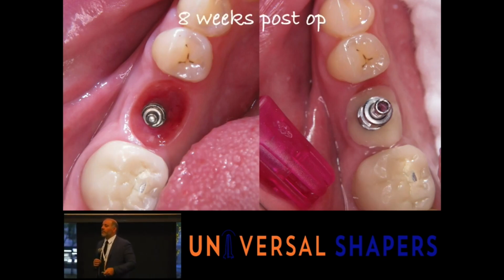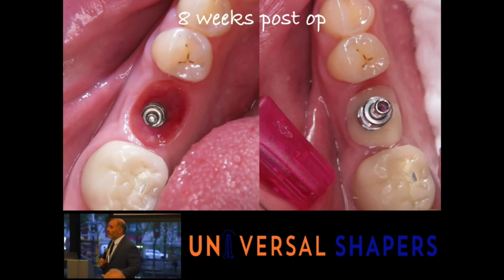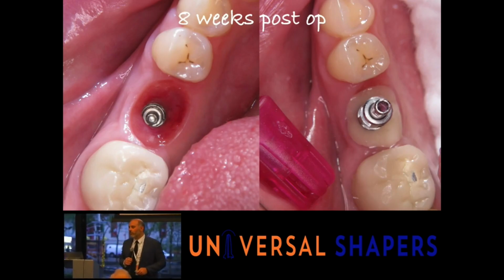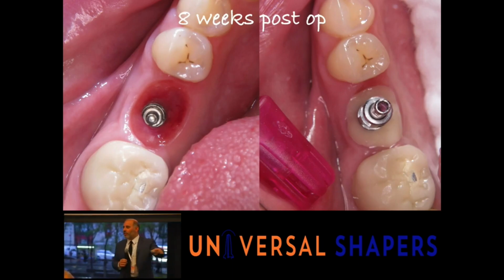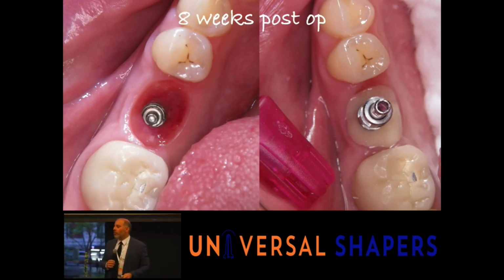8 weeks post-op, this is what we do. We do a lot of ISQ readings, so we like to load early. We have a question? So now he's asking if I scan new cases, and all my cases are pretty much digital. Oh, absolutely. What I love about intraoral scanning is as soon as I remove the healing abutment, I can start scanning immediately. So there's no delay. I'm not waiting for something to be poured. I'm not waiting for painting of a tray. I'm ready to roll immediately.